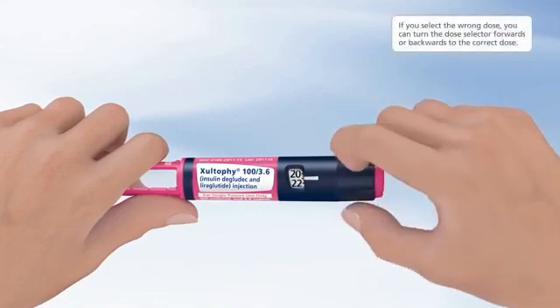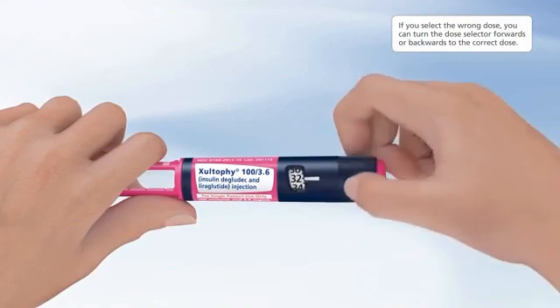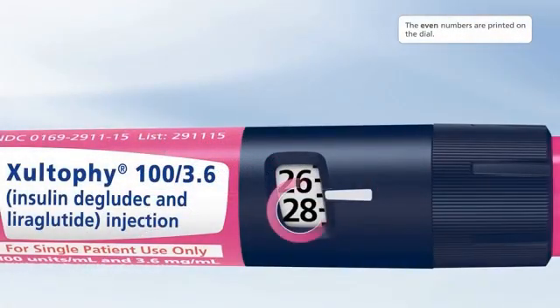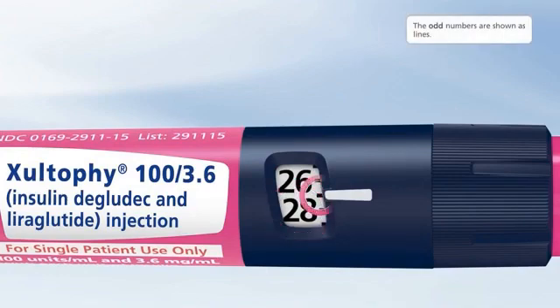If you select the wrong dose, you can turn the dose selector forwards or backwards to the correct dose. In this example, a dose of 27 is selected. The even numbers are printed on the dial; the odd numbers are shown as lines.